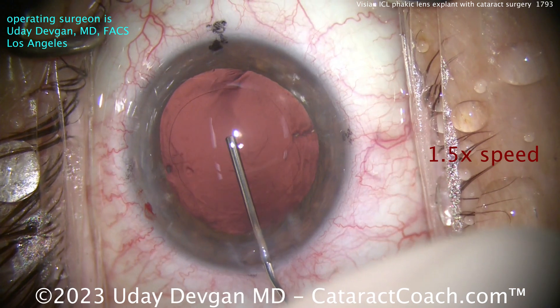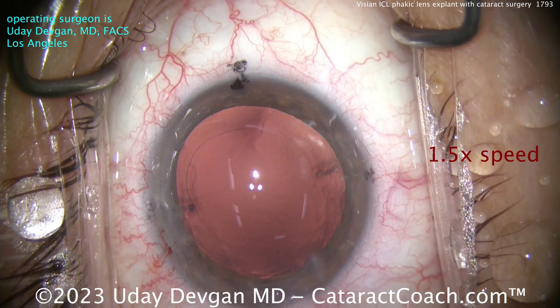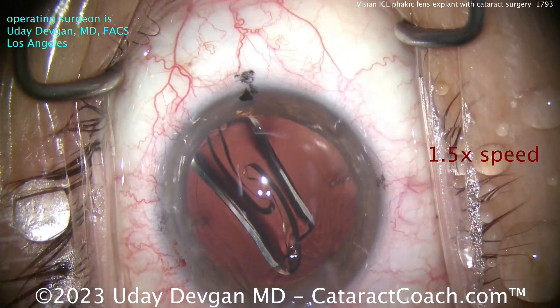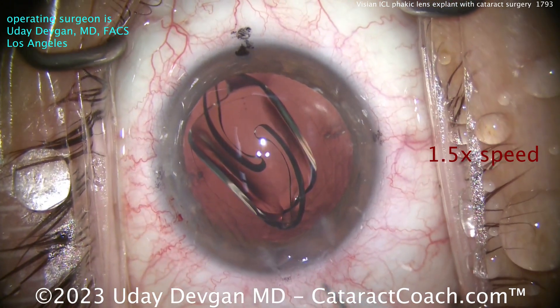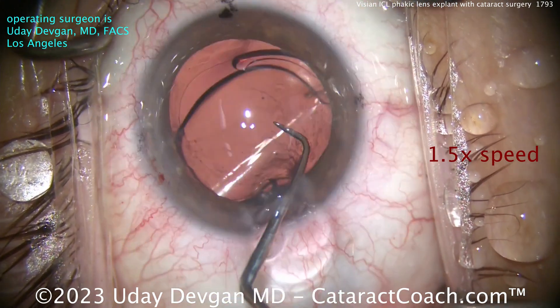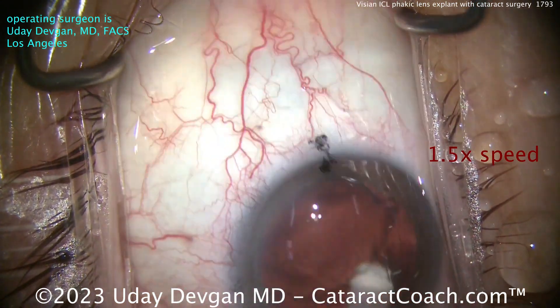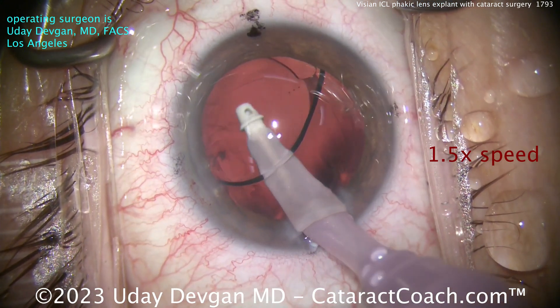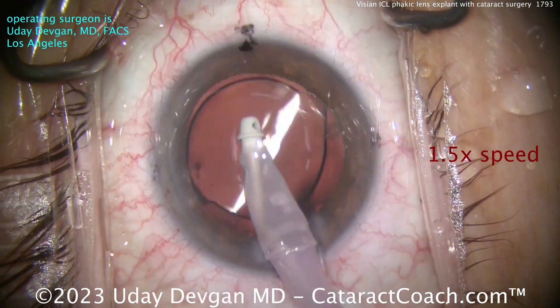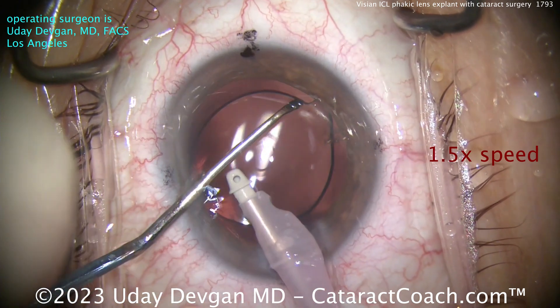You need to have fluidic chamber balance and stability — you achieve that by good fluidics and not having excessive leakage from the incision. There's the IA probe filling up the capsule bag with our cohesive viscoelastic. That incision there temporally is a little on the wider side; we've taken that into account in our calculations for the astigmatism and the toric IOL placement. We've calculated out the appropriate toric lens — the patient has some with-the-rule astigmatism.